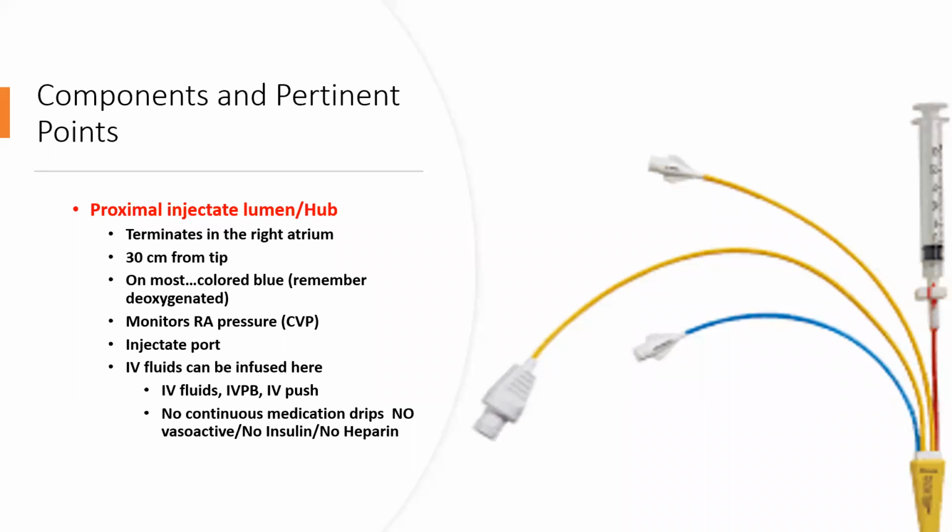So now when you do a cardiac output, you're going to have to inject 20 cc's or 10 cc's of normal saline over here. What that would mean is that you're giving a bolus of the norepinephrine that has been retained right over in this area. And therefore, that would not be good.